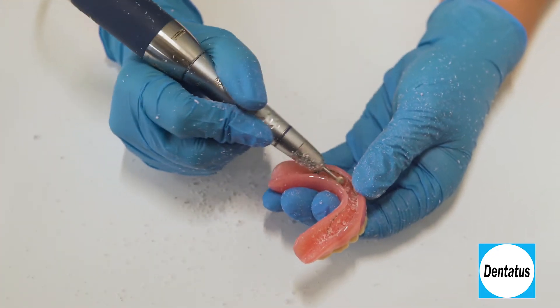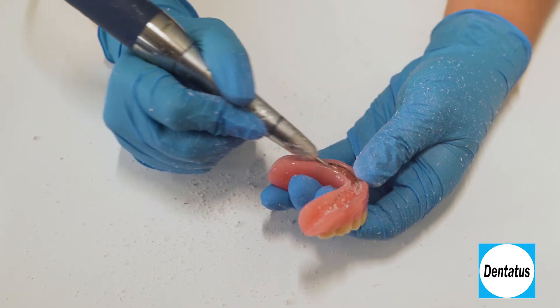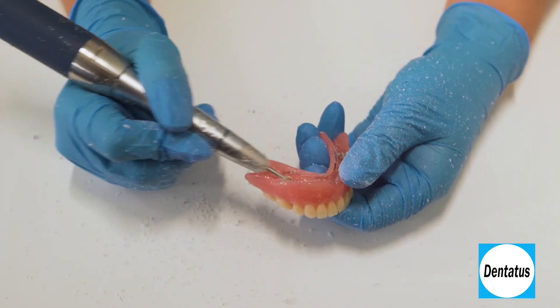Using the 4-millimeter round denture preparation instrument, remove the grooves so that the area is smooth and the relief space is 1 millimeter deep.